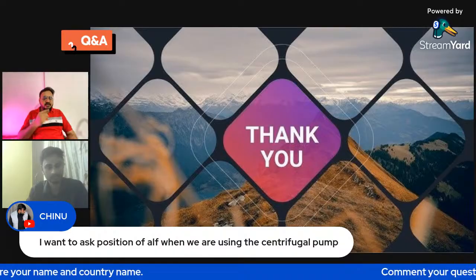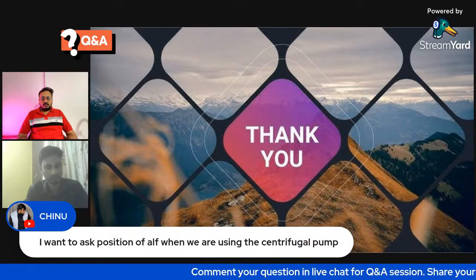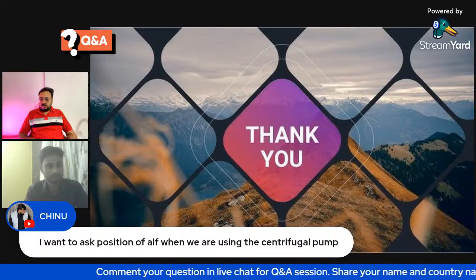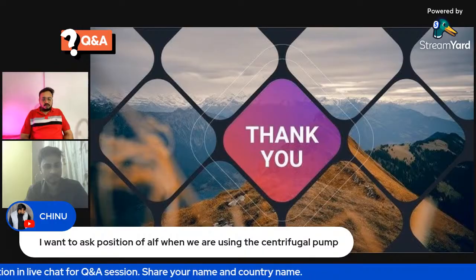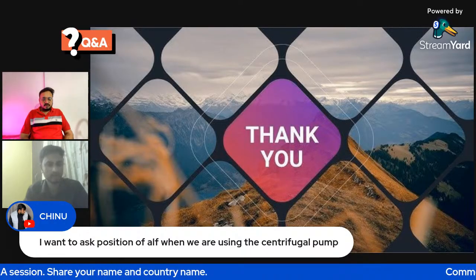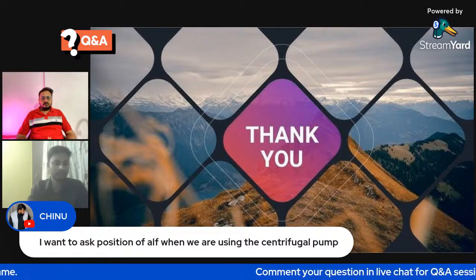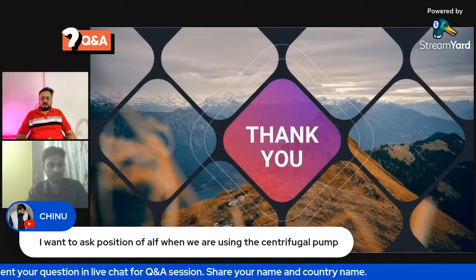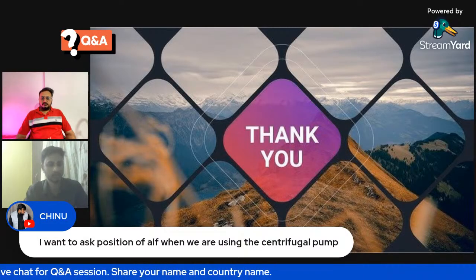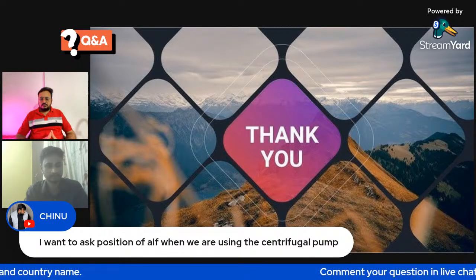So we need a roller pump, right? Yes, we need a separate roller pump. So in that case, it is not possible to do filtration with a centrifugal pump, is it? Yes, sir, we can do it, but we can't predict how much ultrafiltration is going to happen, because with a roller pump we have to watch line pressure and so on. This one is a preload and afterload dependent pump.